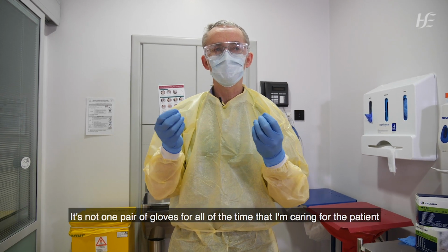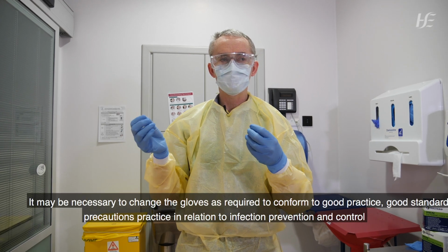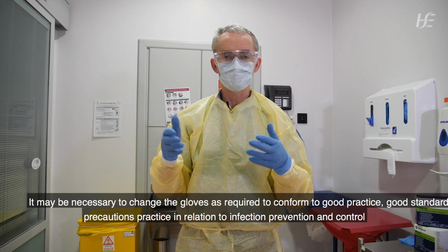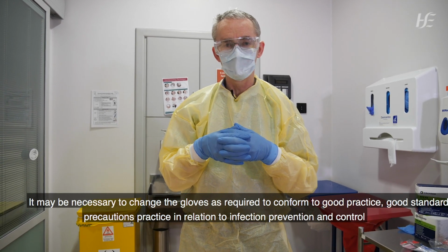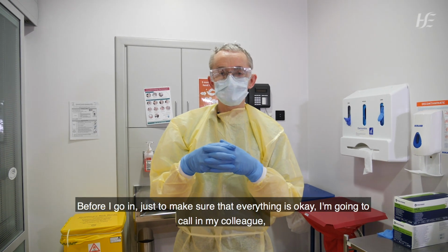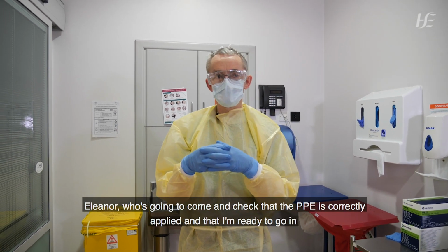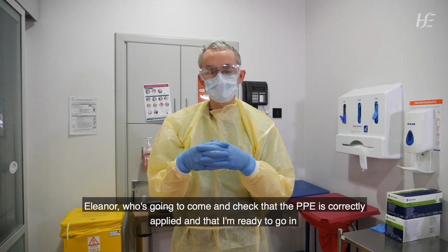So it's not one pair of gloves for all of the time that I'm caring for the patient. It may be necessary to change the gloves as required to conform to good standard precautions practice in relation to infection prevention and control. Before I go in, just to make sure that everything is okay, I'm going to call on my colleague Eleanor, who's going to come and check that the PPE is correctly applied and that I'm ready to go in.